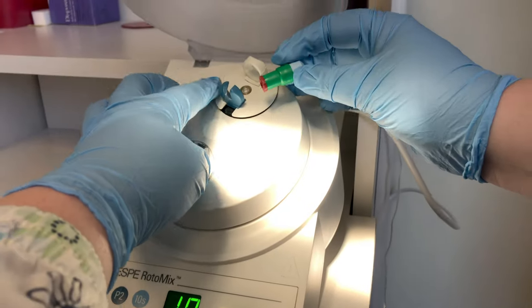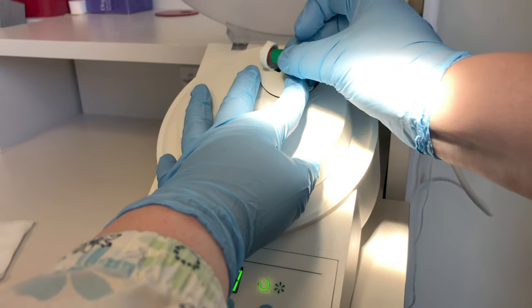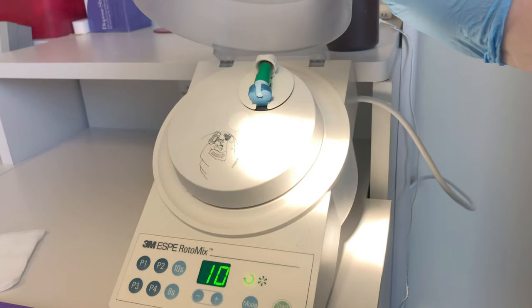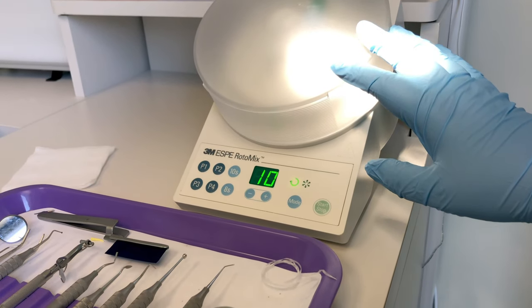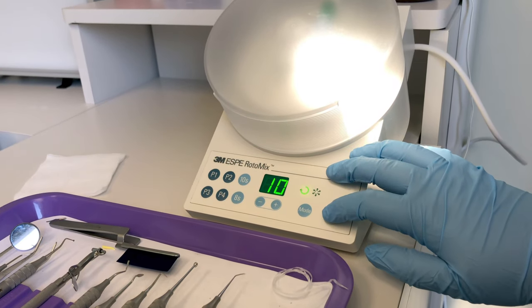Lift the lid up and open the holding device for the rotomix — you just turn it and release, and it will squeeze the capsule inside the ends. Close your lid, make sure you've selected the proper time for your type of amalgam, and press start.